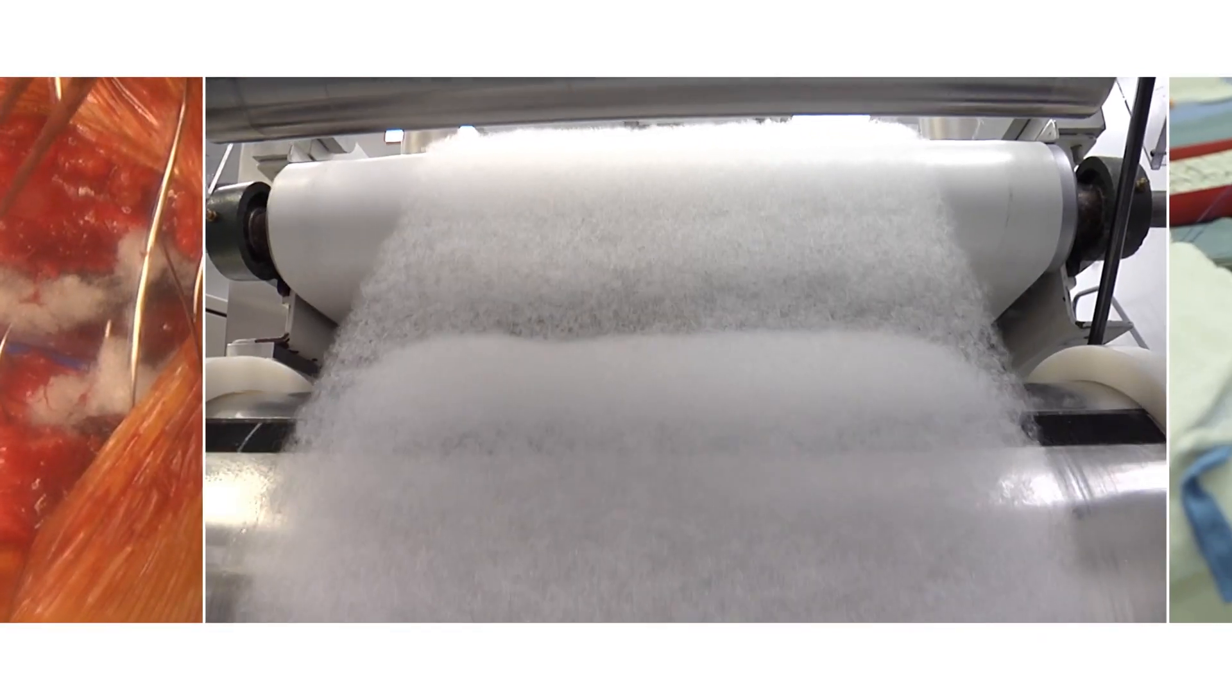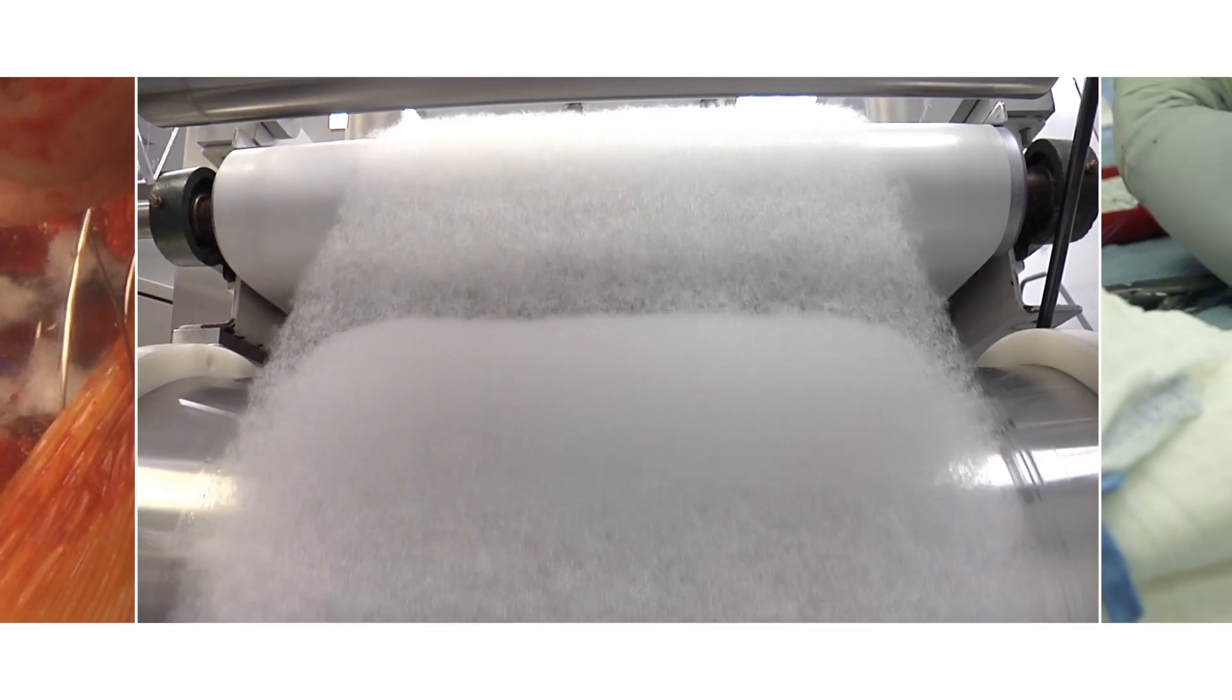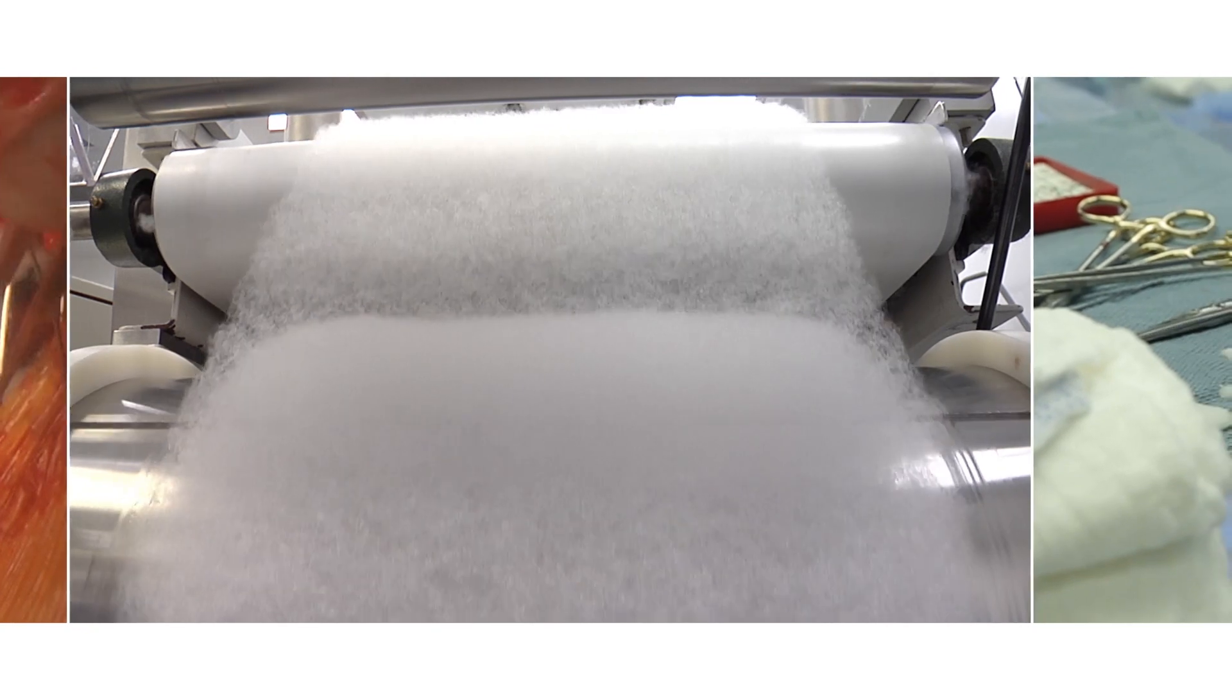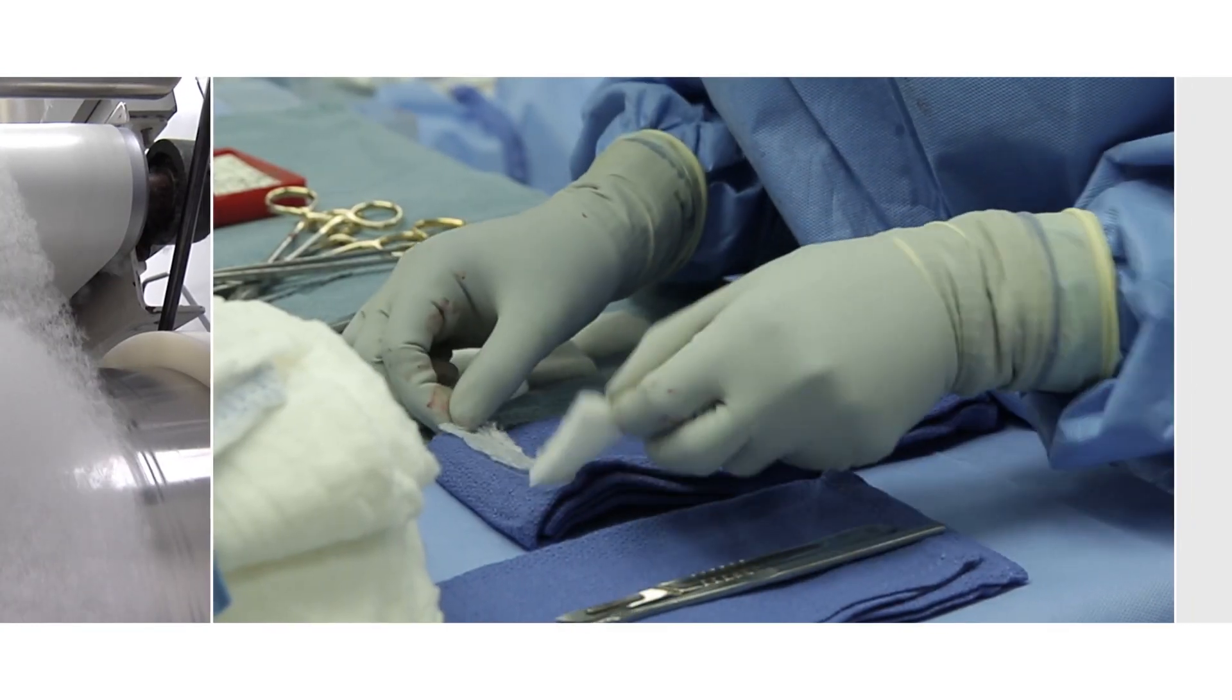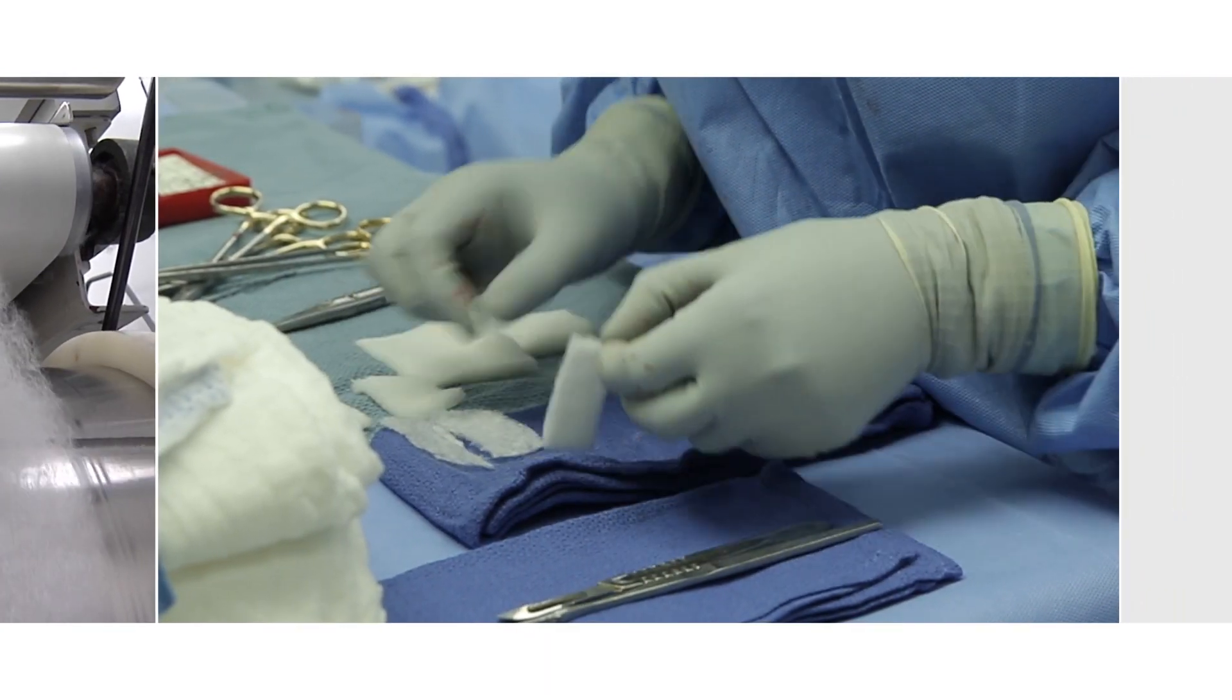Because they are non-woven, advanced Surgicel hemostats also have unique handling capabilities. Surgicel Fibrilar has a layered construct that can be teased apart easily, allowing precise placement in challenging procedures.